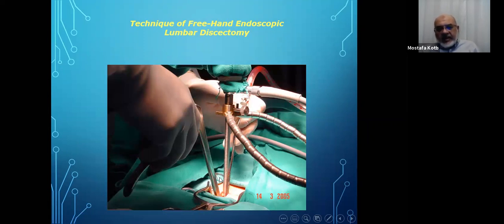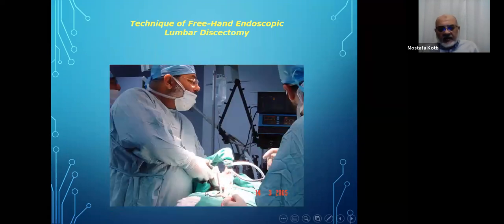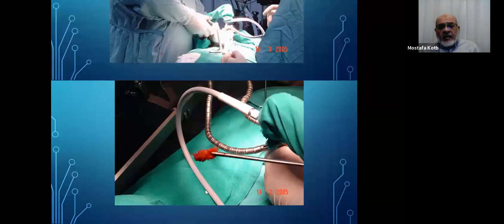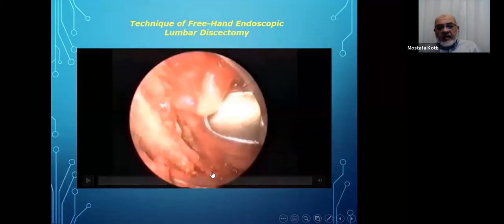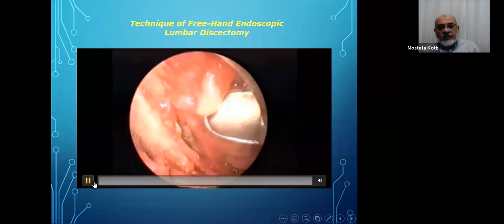Then you can take out both the lamina and the disc with all your regular instruments that you use in microdiscectomy or in any naked eye discectomy. And this is how much disc you can take with this technique.